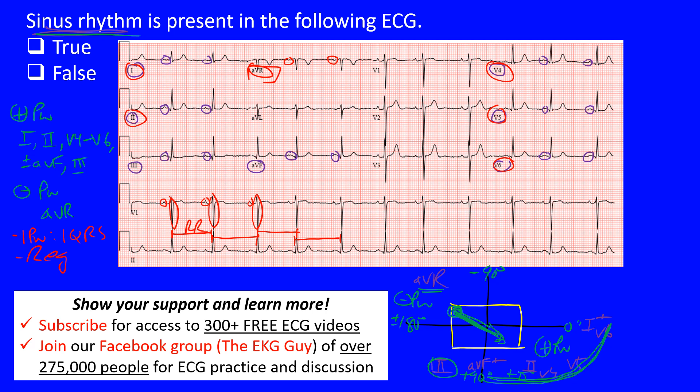With a first-degree AV block, sinus rhythm can still be present. You can also have AV dissociation — as long as the rhythm originates from the sinus node, we still say sinus rhythm is present. That's why the 1:1 ratio and regularity criteria are highlighted in red: don't rely on them too heavily. Based on all of this, sinus rhythm is certainly present in this ECG.